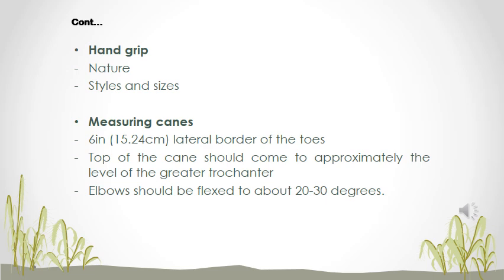In a standard cane, you will find that the hand grips are often beautifully styled in different sizes, out of wood, and you will find very interesting canes, different types of hand grips.